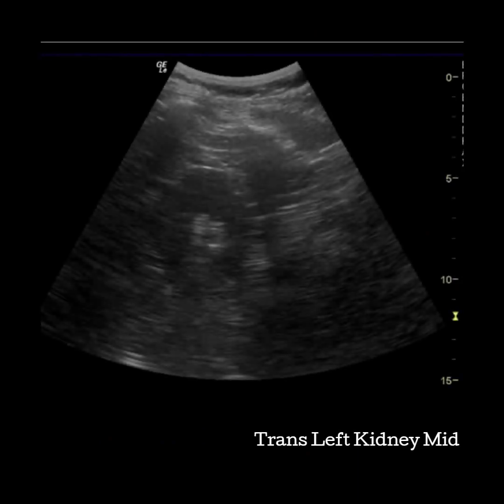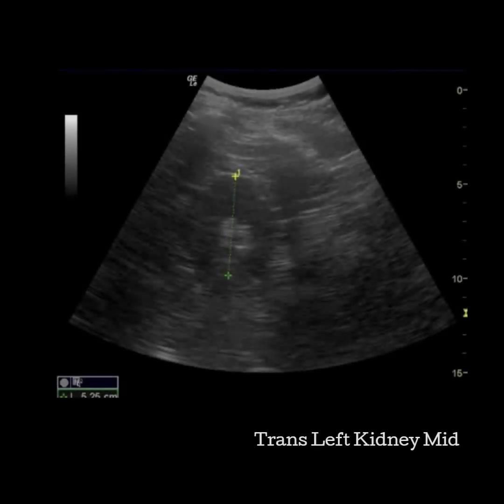Slide the transducer towards the patient's feet and look for the kidney to take on a C shape. Due to the use of the coronal window, this may actually be more of a lowercase n shape with the hilum facing deep into the image. This image is measured again, cutting the kidney in half through the hilum so there is even parenchyma on either side. Note that the measurement is not transverse on the image, but transverse to the kidney.